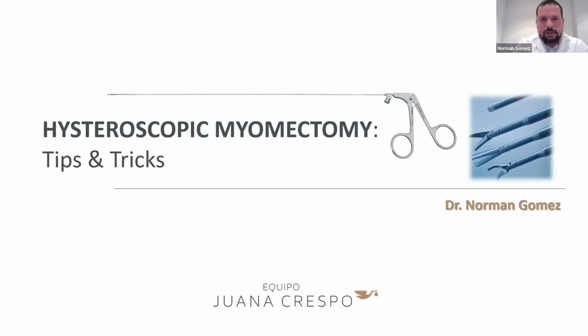So we have a particular way to do this kind of procedure because normally we are more conservative with the endometrial cavity because we need to optimize the embryo transfer after the surgery. So we try to avoid the use of energy in some way inside the uterine cavity to preserve the endometrial cavity. I will share my vision about this kind of procedure and hope this helps you in your daily practice.